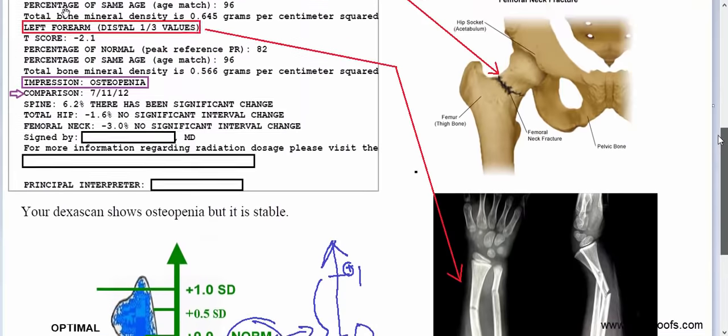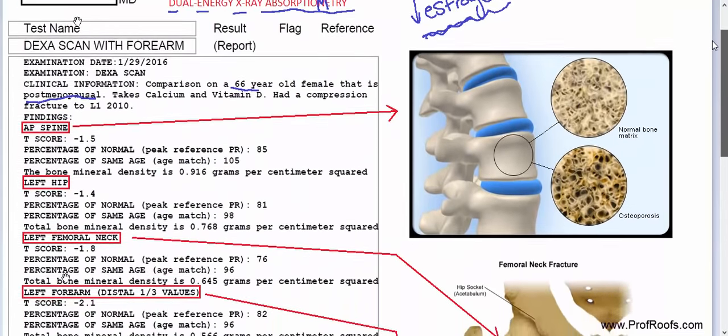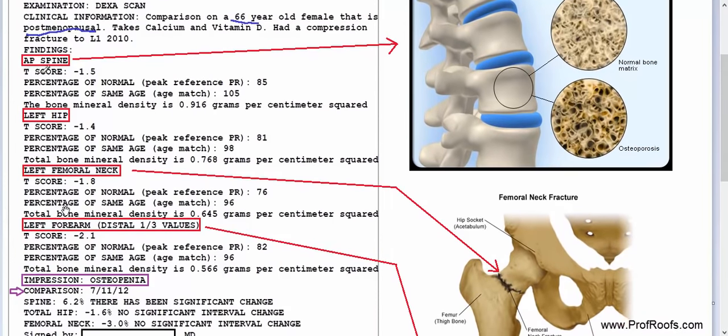So where do you read these? You read them on what we call a T-score. If you notice here, we have four sections we're looking at: the anterior-posterior spine (AP spine), the left hip, the neck of the femur on the left side, and the distal part of the forearm. We're looking at the T-score of each one. The T-score is determined by standard deviations.